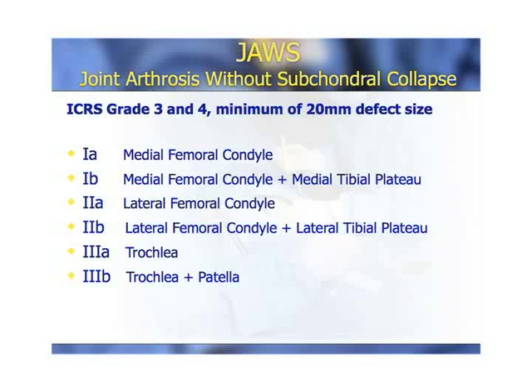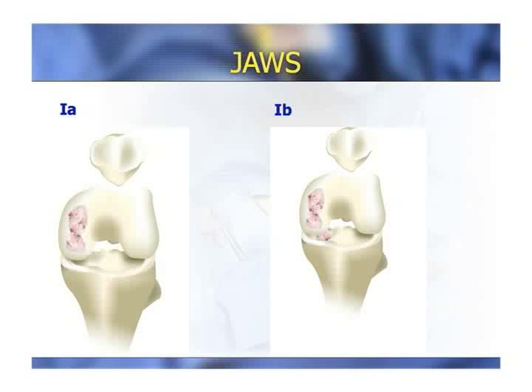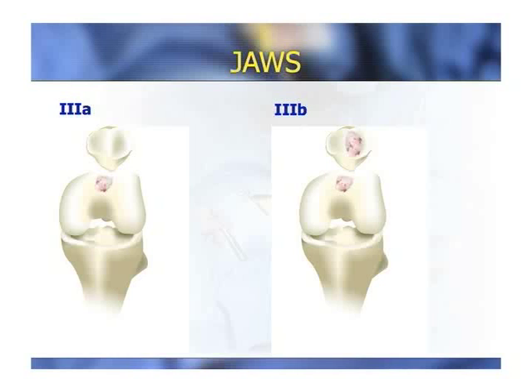Basically, the classification system is based on an ICRS grade 3 or 4, being at risk for propagation by having a 20 millimeter defect. And so it's fairly intuitive. A 1A lesion just has medial femoral condyle involvement. A 1B lesion has a kissing lesion on the tibial plateau that you want to resurface. A 2A is lateral femoral condyle, 2B is lateral femoral condyle plus lateral tibial plateau, 3A is just the trochlea, and 3B is the trochlea and the patella. So here are some schematic representations of these examples, a 1A and a 1B, 2A and a 2B, 3A and a 3B.